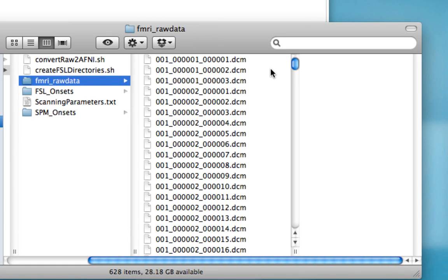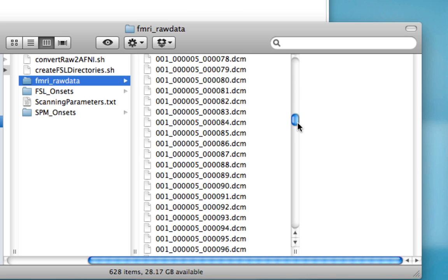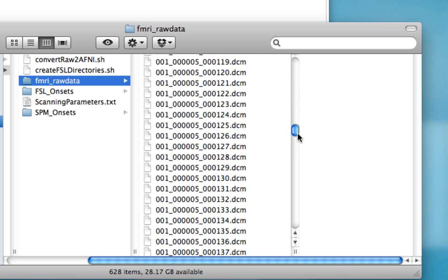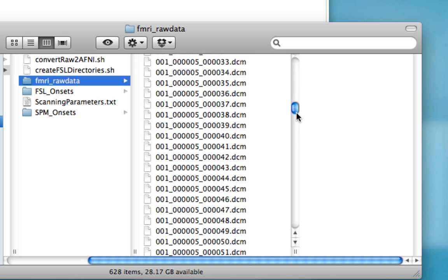If we go back to here, we know from the text file that the functional scans begin at run five.